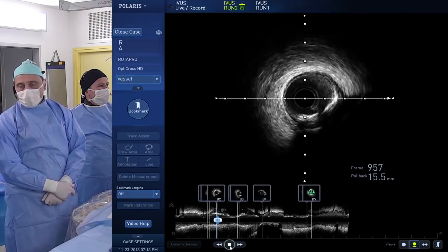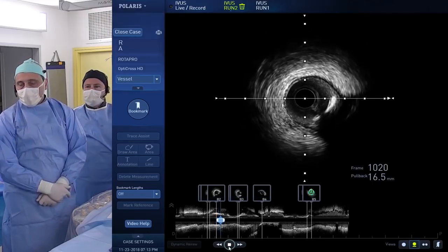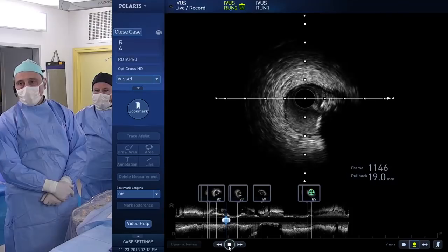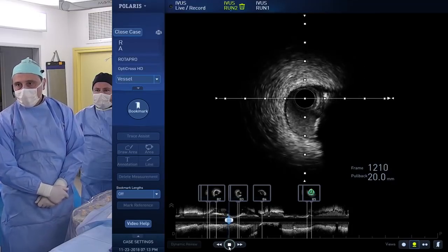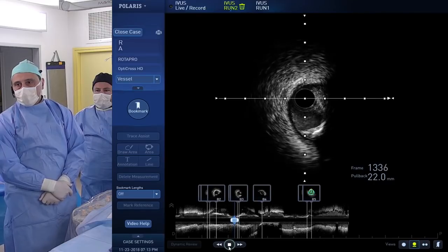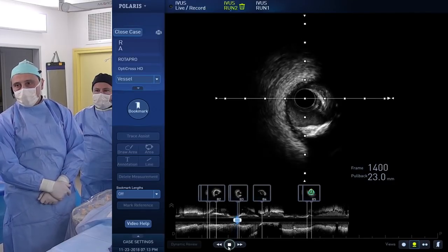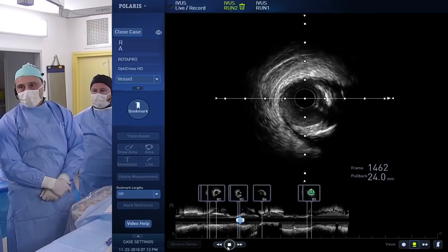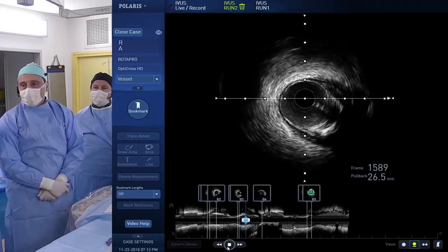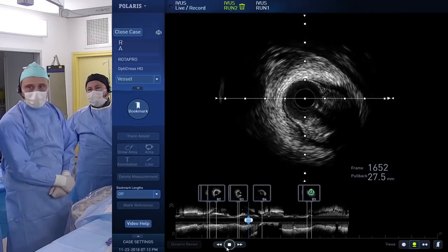But you will see shortly that there are even segments with 260 degrees calcification, so really 3 quadrants. So far we're still with 2 quadrants, and that was what really triggered our decision. Well, there you go. Here you have more than 2 quadrants involved, and that is for us a good enough criterion to start rotablation as a first intention.